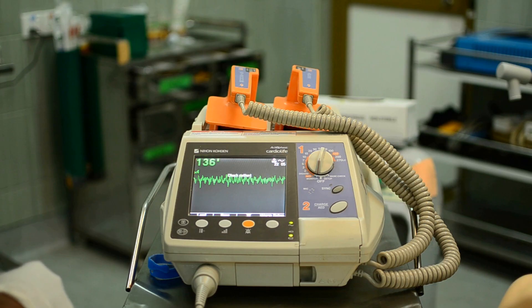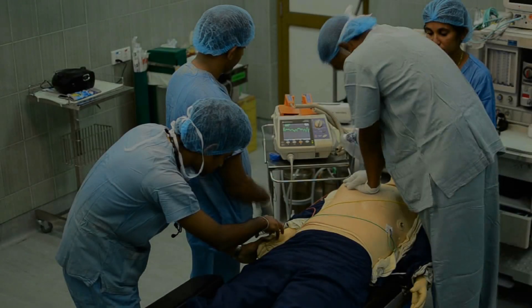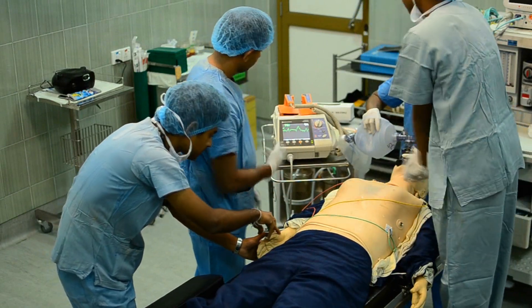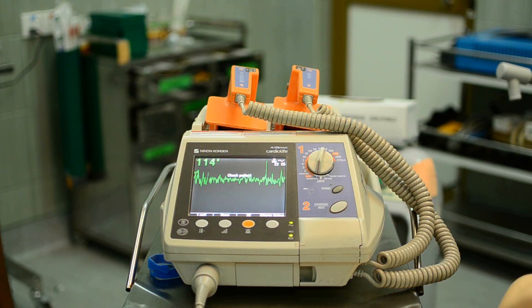Stop disturbing the signal. When the lead is selected and the scale corrected, the defibrillator is ready to monitor the patient. If a rescuer is massaging the patient, ask them to stop massaging and try to analyze the waveform. Decide whether it is shockable or not, then ask the rescuer to continue massaging.